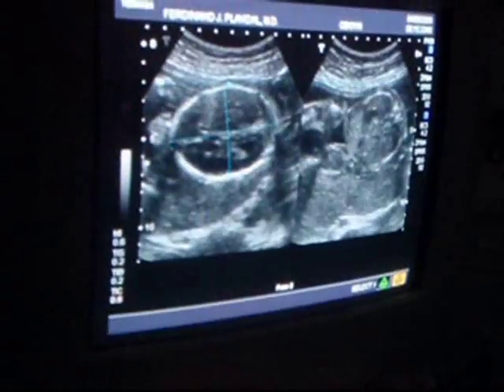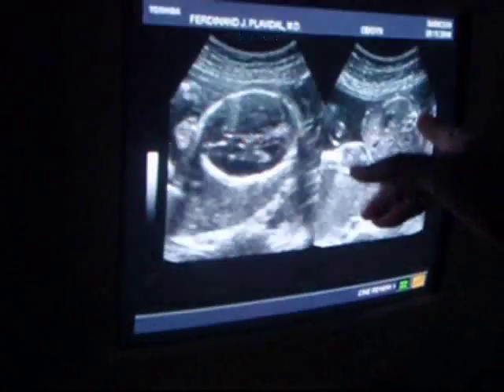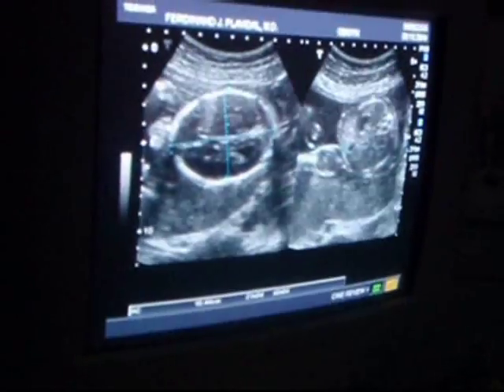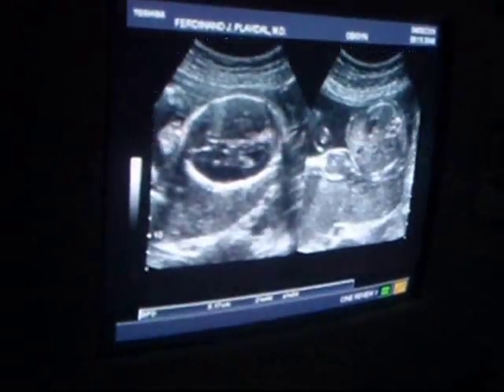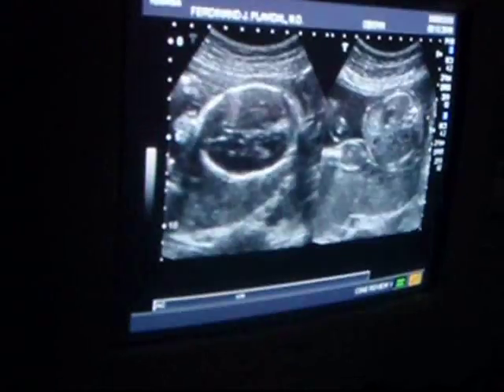And here's the abdomen on this baby. Again, you can see the fluid-filled stomach, the circular spinal column right here. And so we'll just go down here. Turn it off, come back on, and ask the machine for an abdominal circumference. Erase that, thank you very much.